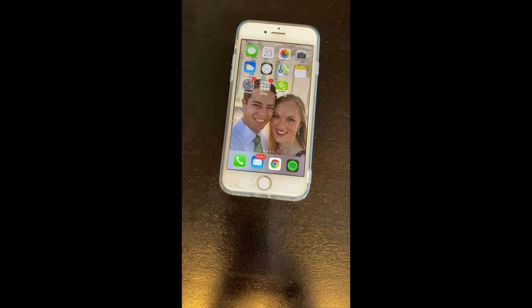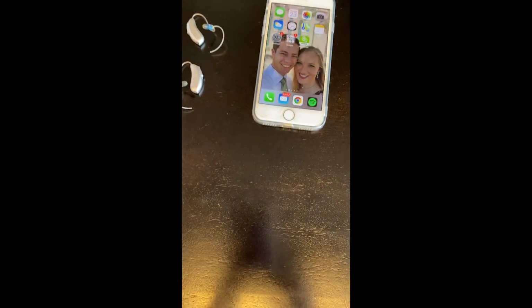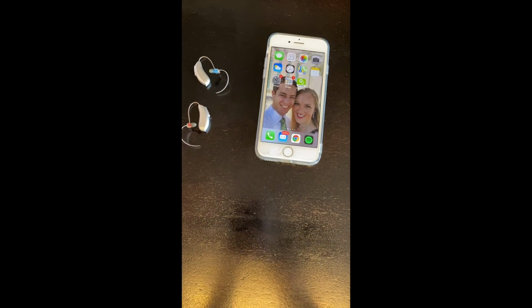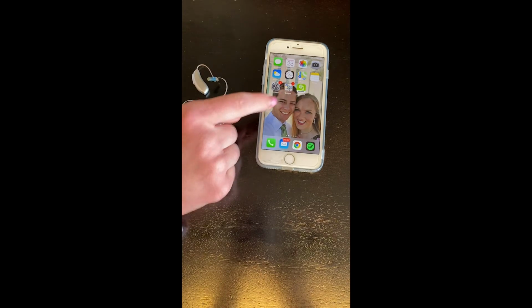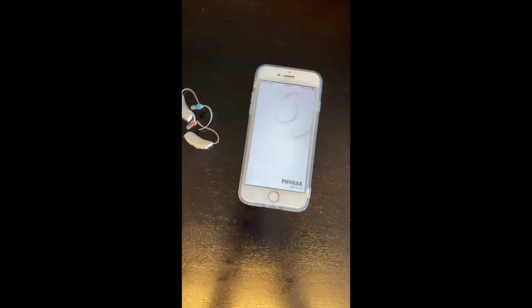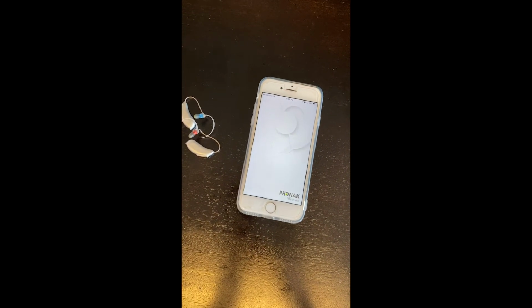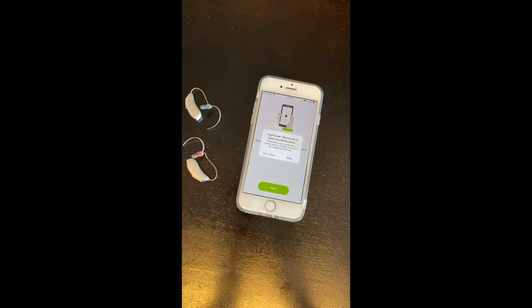Today we're going to learn how to use the Phonak app for our Phonak hearing aids. If you have newer Phonak hearing aids, you definitely want the My Phonak app, which looks like this. And you're going to click on that. We're going to make sure everything's connected. This will be our first time connecting these hearing aids to this app.